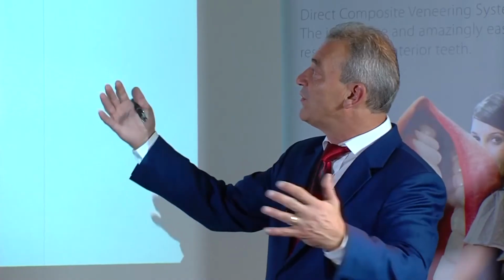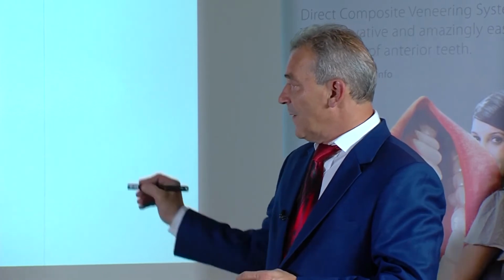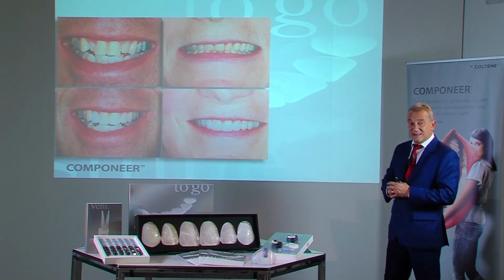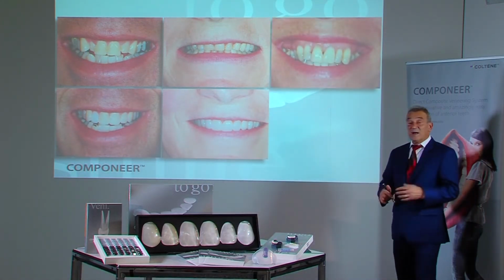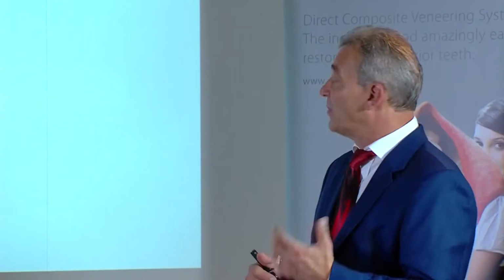Just imagine the dental arch somewhat rounder. This means applying some composite. This makes the dental arch somewhat rounder and the teeth are straight. This effectively demonstrates to the patient that preparation is not required. At the same time, I can see that I do not need to perform preparation.